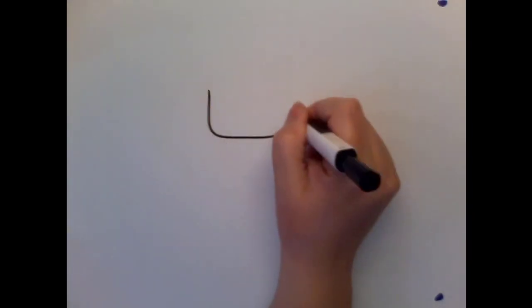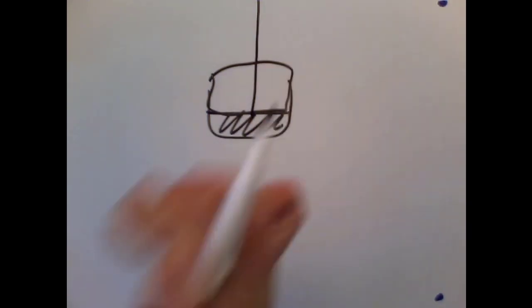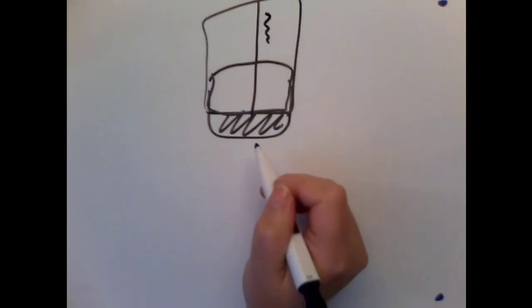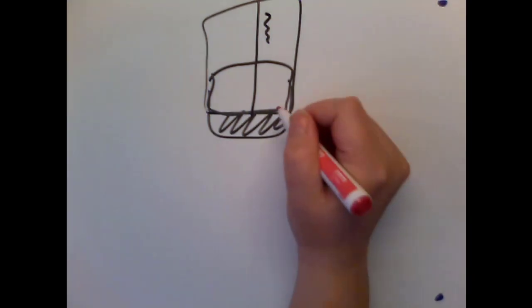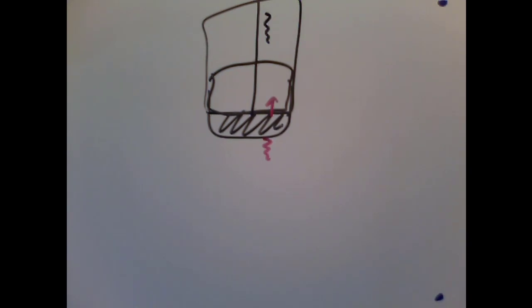So again, if this is our transducer, our PZT crystal is here, and then we have our backing material here, and our wire coming back. So this is the rest of our transducer. During transmission, electricity comes down the wire and interacts with the PZT crystal. Some of that sound is going to get absorbed by the backing material, and that little pulse is going to come out.